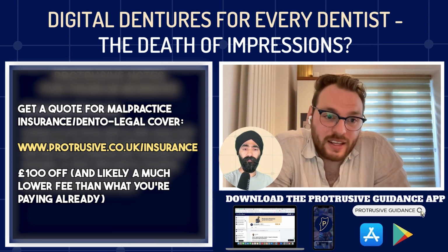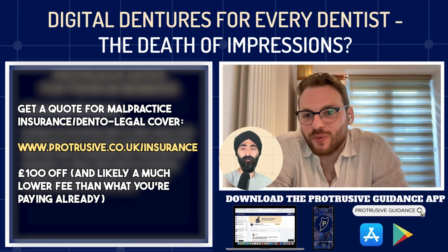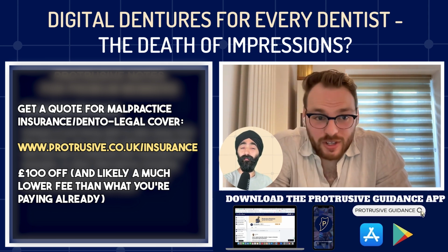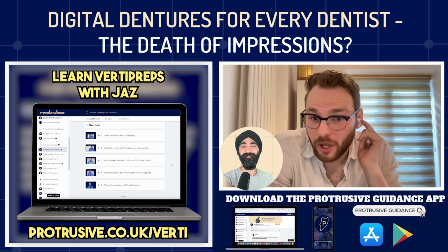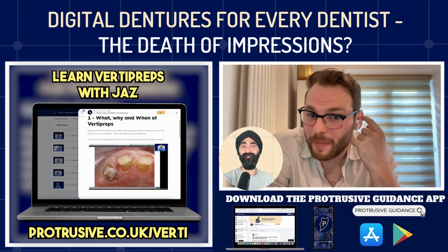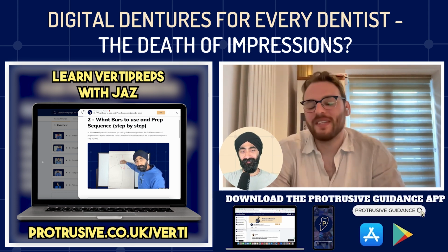And that's the interesting one, the under-extension with a scan as well. That's the misconception: you go, oh, I'm doing a complete digital denture, I'm going to scan soft tissues. By the way, that's the 9th case we've done side by side, and that's the only one where they preferred the analog when we scanned the soft tissue, because it was okay.